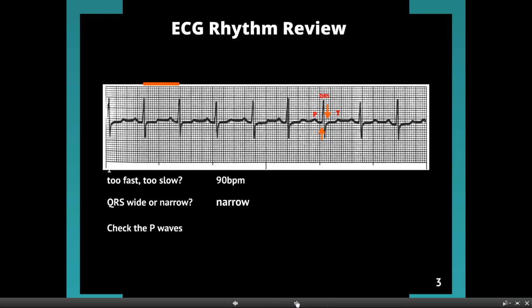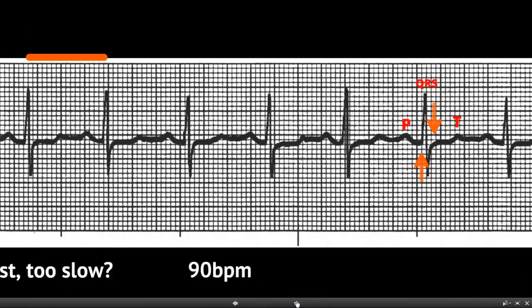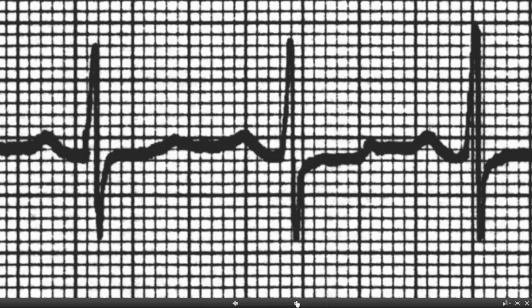Our next question: we're going to check the P-waves. Let's zoom in here. We have three complexes here. Take a look and see if you can find the P-waves — we've got three of them in here. Starting at the left, we've got one right there, one right in the middle, and one right there. They are present and they are in front of every QRS. They look pretty much the same, which tells us that the SA node, each and every time, is the one starting the contraction.